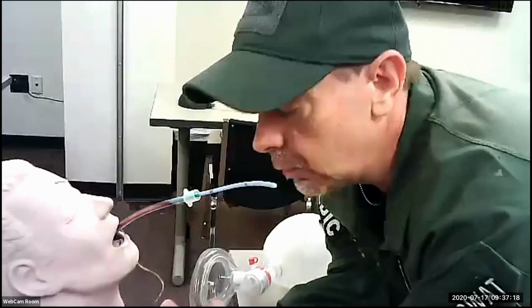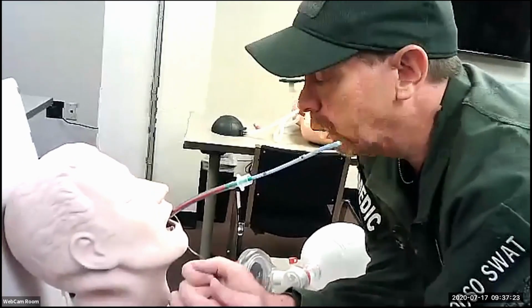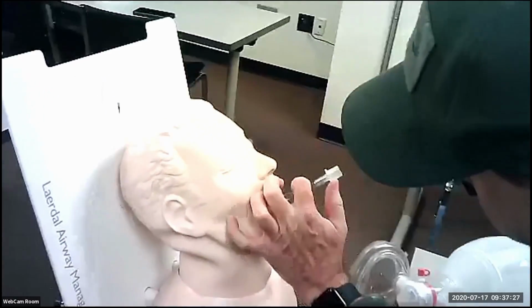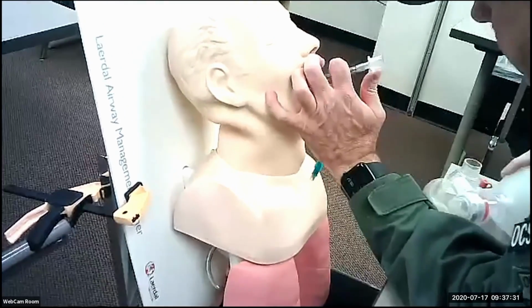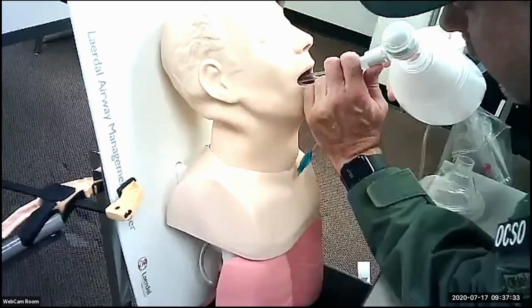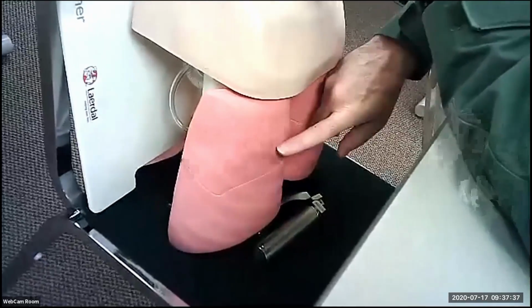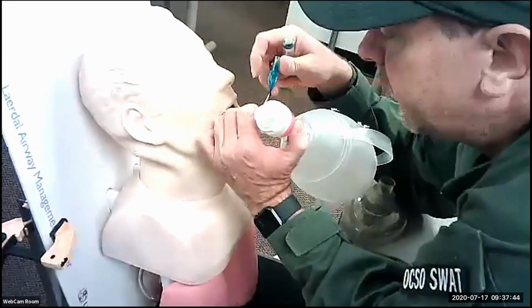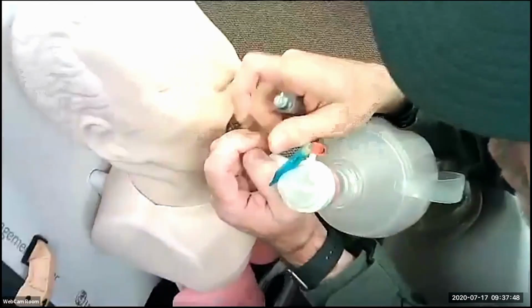If you go any deeper than that, you get what we call main stem intubation, so you're actually going to the right lung. You only get one lung inflated. I'm going to demonstrate that. If I go too deep, you'll see the lungs down here. You see this one lung inflating, the other one is not. Let me inflate the cuff. So at the end of this breathing tube is basically a balloon. I'll show it after we pull it out.